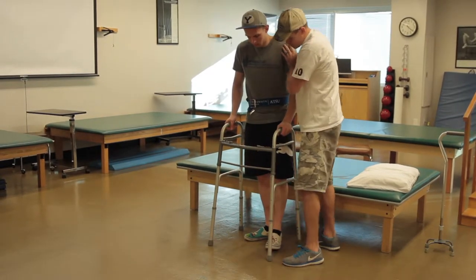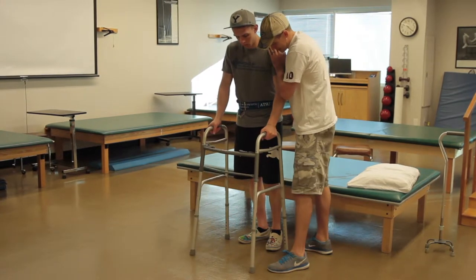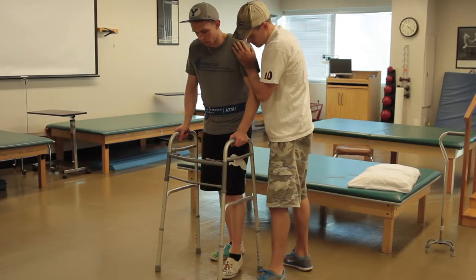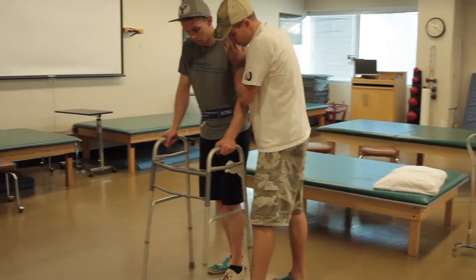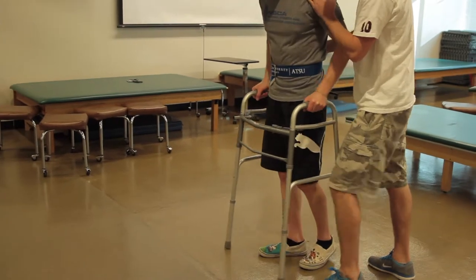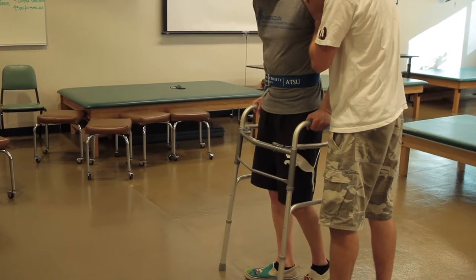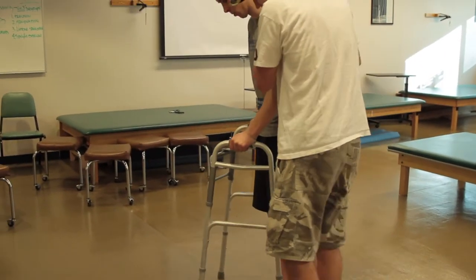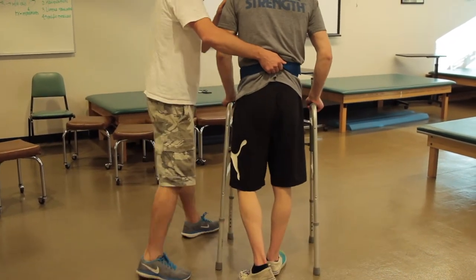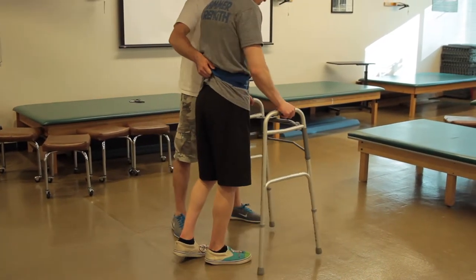Perfect. Okay. So the sequence for this is you're going to use the walker first. So walker, this left leg or the involved side, and then the right side. Perfect. Walker. Perfect. So you're partial weight bearing, so you can put no more than 50% of your weight on that side. Doing good. Okay, so now we're going to turn toward the right, so toward the side that's not the surgery side. Same thing, make sure those toes stay straight. Perfect. Good. Feeling okay? Okay, now go toward that bed.